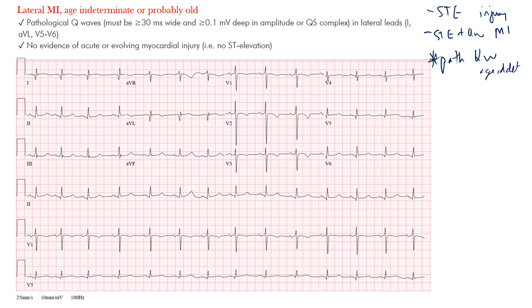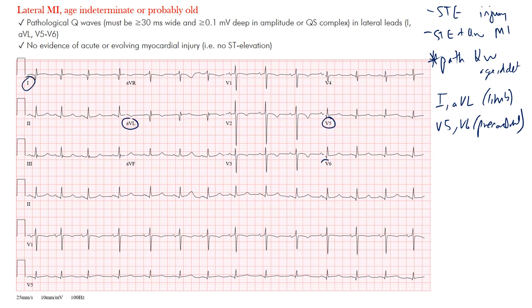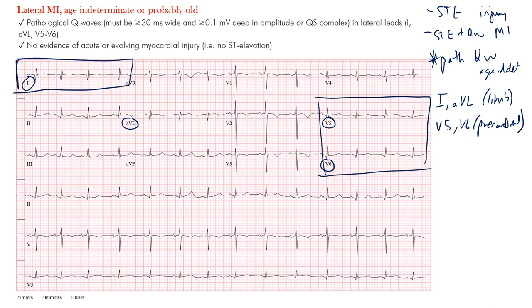Because it's a lateral MI, we're looking in the lateral leads. The lateral leads are I and AVL of the limb leads, and then V5 and V6 of the precordial leads. On the standard 12-lead EKG, here's lead I, here's lead AVL, here's lead V5 and V6. You're looking here, and also here to localize it. Those are the lateral leads.